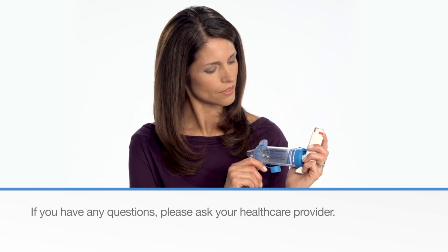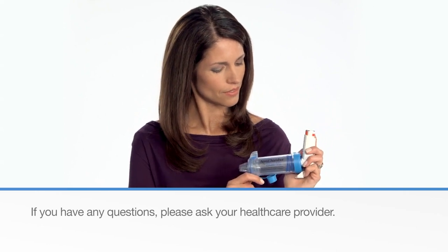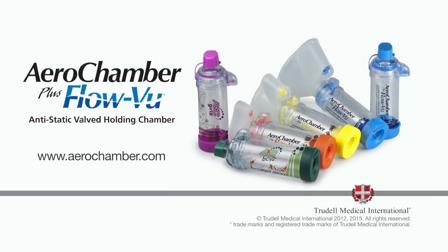If you have any questions, please ask your health care provider. For complete instructions, please refer to the patient instructions available on our website.